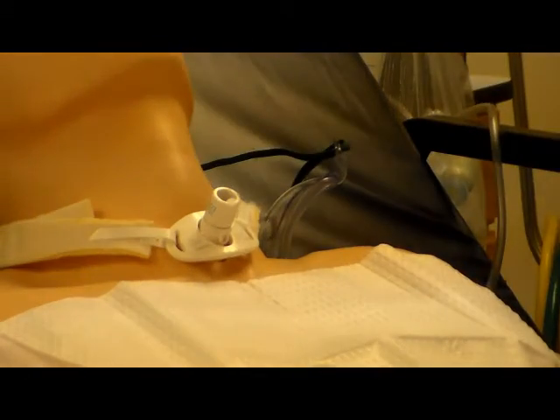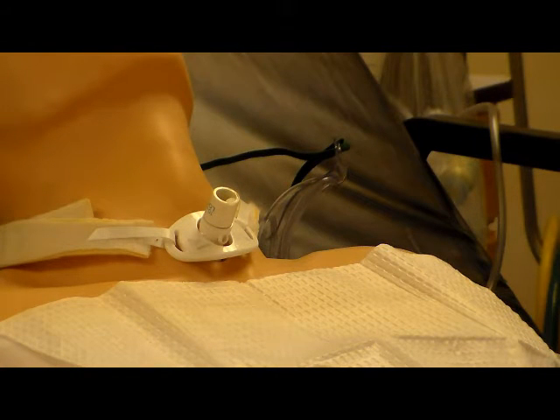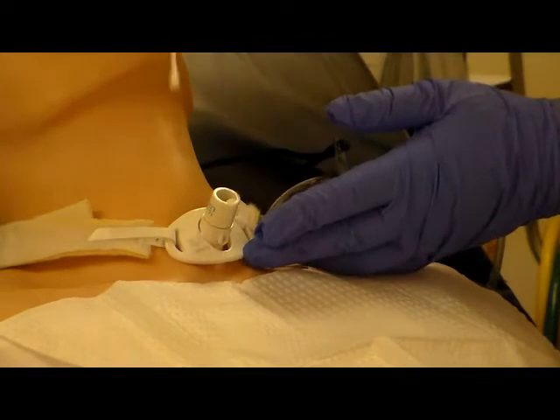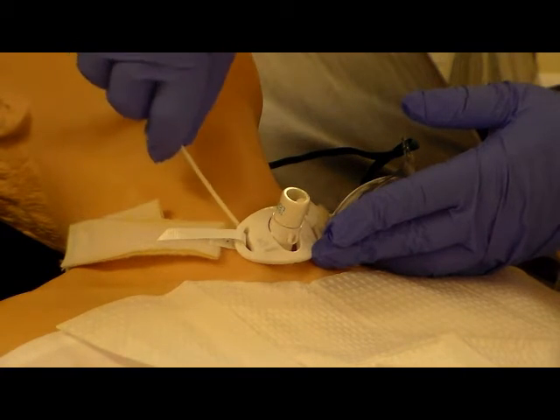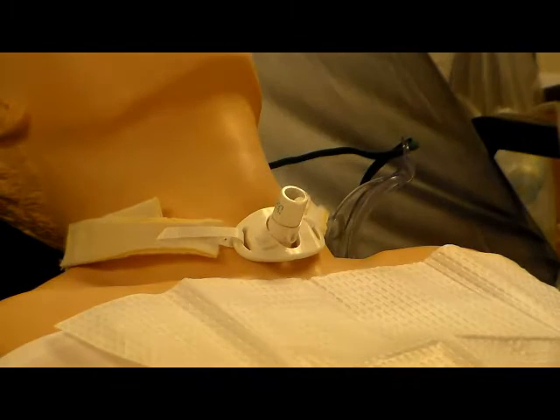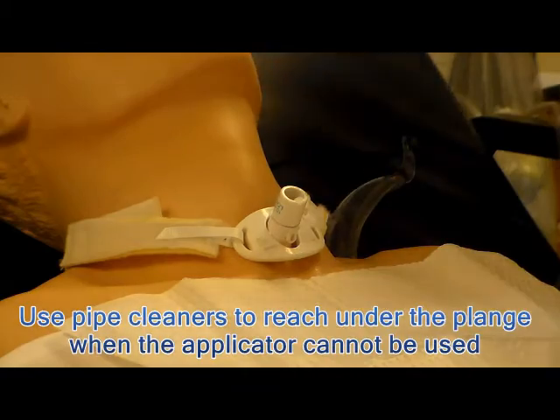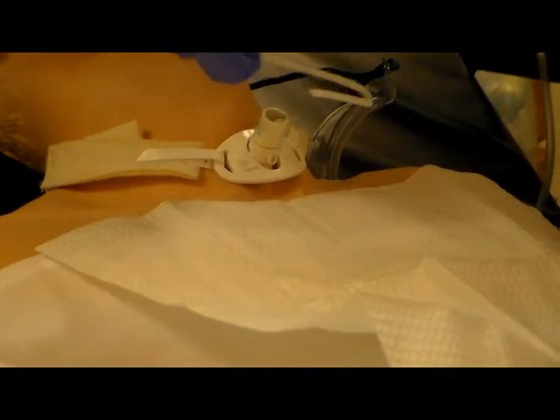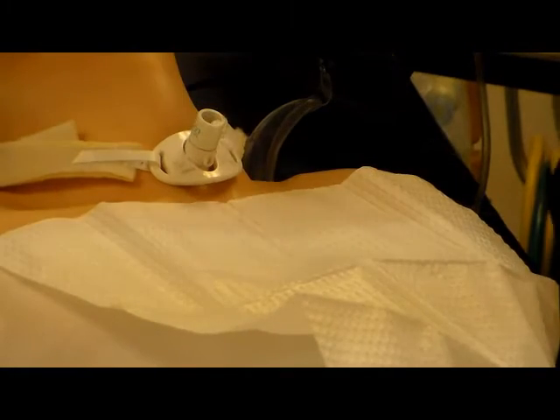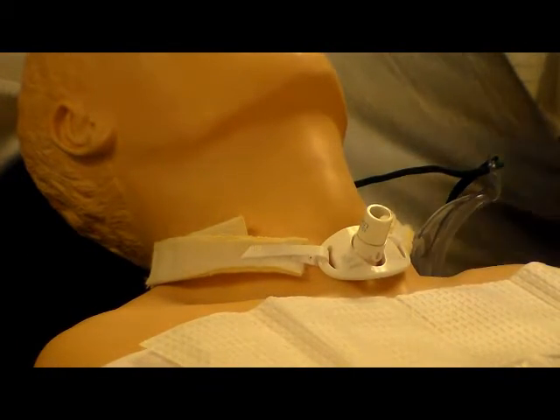One of the things that will happen with hydrogen peroxide in the presence of protein is it will begin to bubble, and that sometimes tells you there is mucus or even some bleeding in the area. If you have difficulty, you can also use the pipe cleaners, which are useful for tight trachs. Dip the pipe cleaner into the hydrogen peroxide or saline depending on the situation — it allows you to bend it and reach around areas of the trach. In this case there is plenty of opening and we were able to do everything with the q-tips.